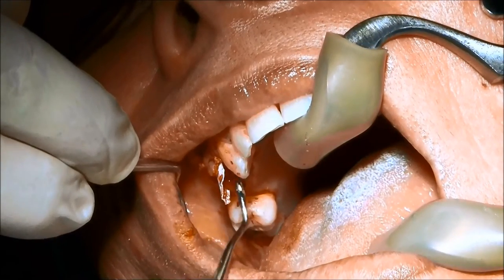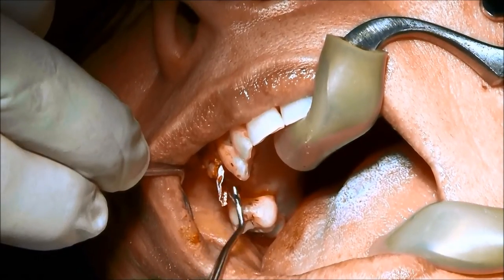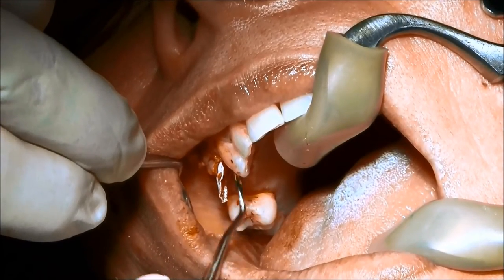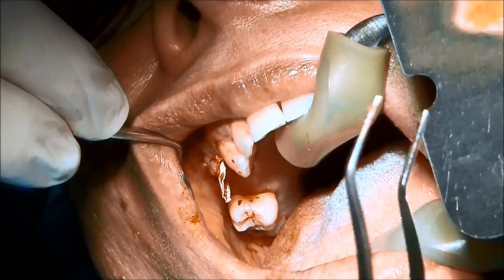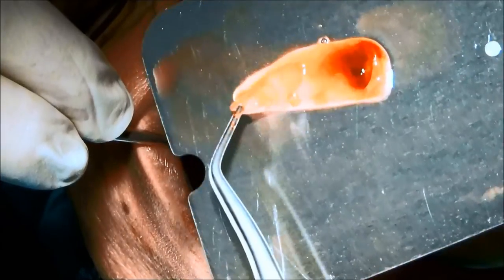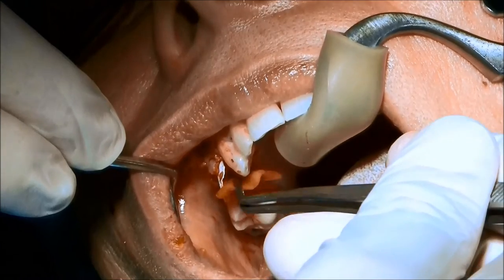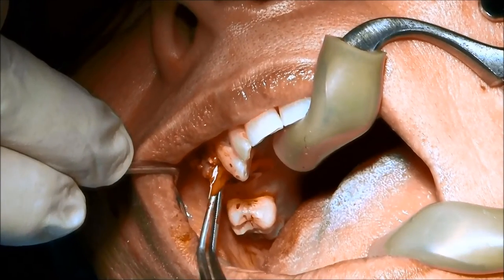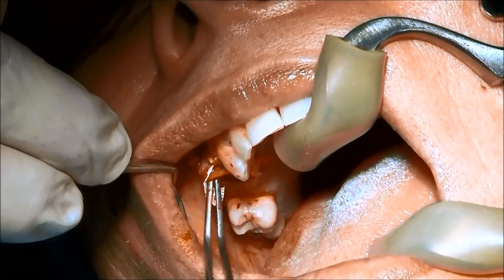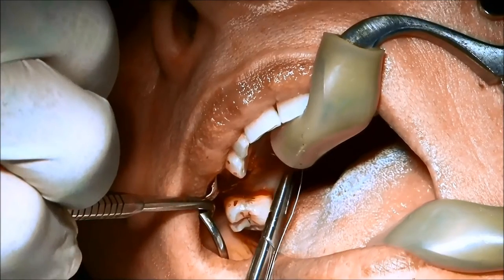I'm ensuring that the membrane is flat and positioned correctly on that facial tunnel flap. We're protecting the bone on the facial side and also on the top of the implant. We're gently repositioning the bone, as some particles move as I pull the membrane. I'm going to keep that current tissue facially to the implant.